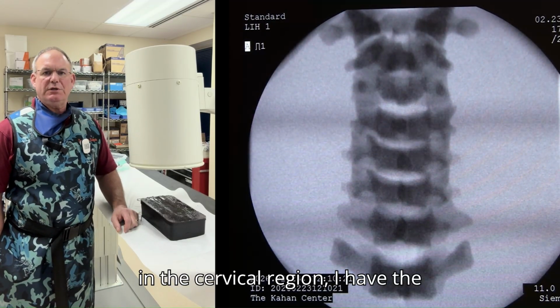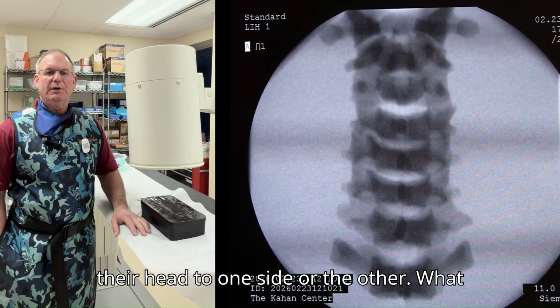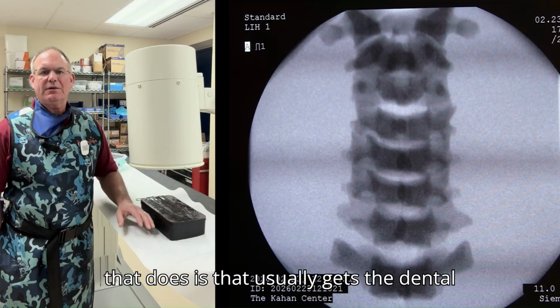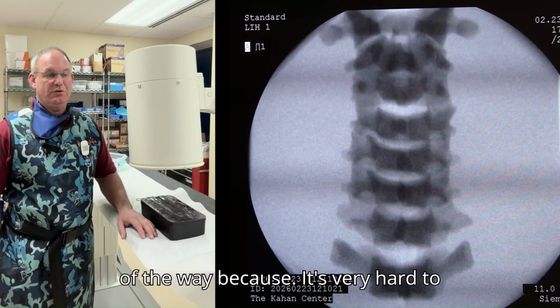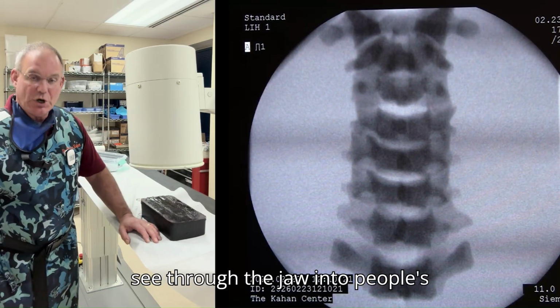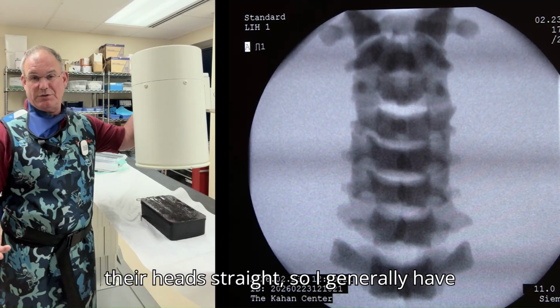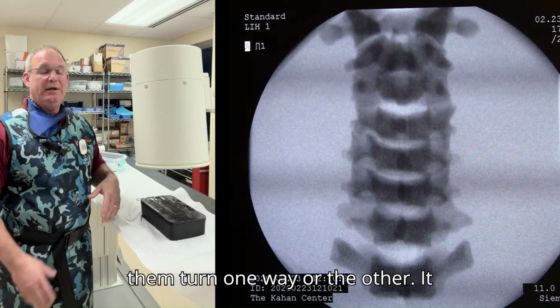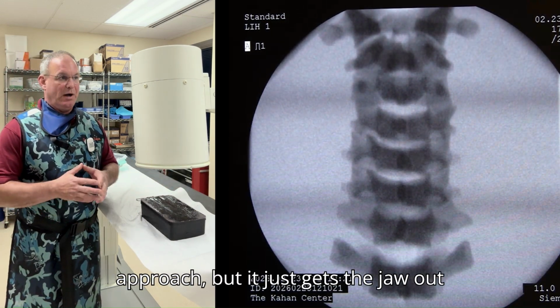When I'm usually starting in the cervical region, I have the patient lie prone and I have them turn their head to one side or the other. What that does is that usually gets the dental work out of the way and the jaw out of the way, because it's very hard to see through the jaw into people's cervical facet joints if they keep their head straight. So I generally have them turn one way or the other. It does not change your view or your approach, but it just gets the jaw out of the way.